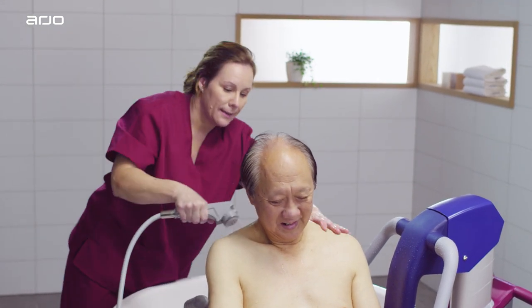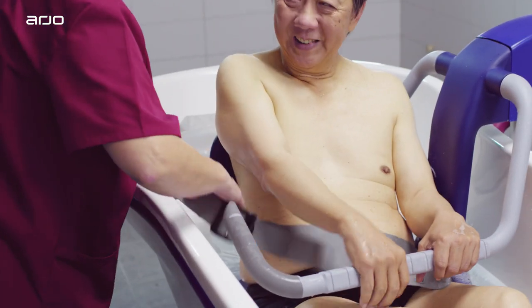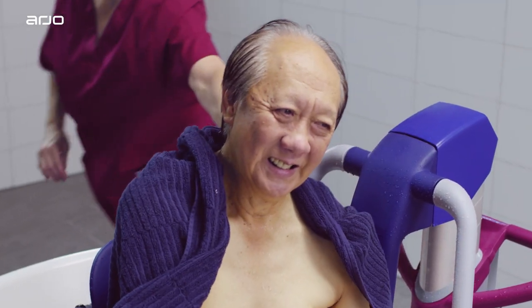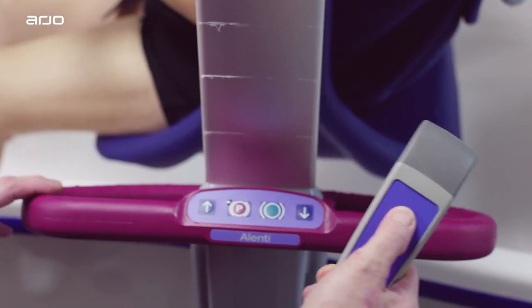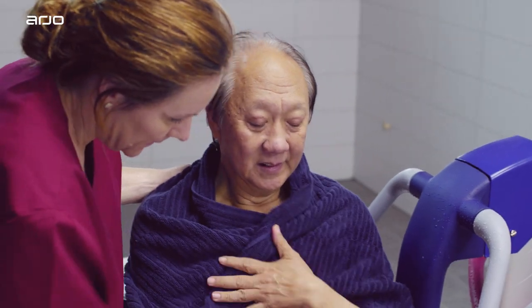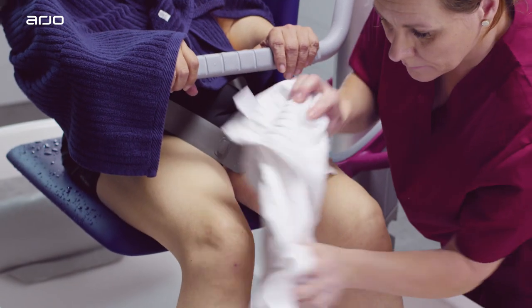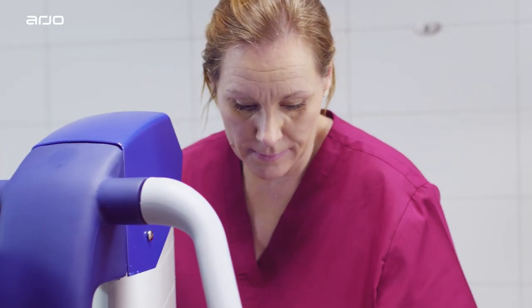After rinsing the resident with the shower, stop the flow of water by pressing the shower button on the control panel. Remember to cover the resident with towels to keep them warm. You should now separate the Alenti seat from the bottom of the bath. The resident should continue holding onto the handle while you complete this task. To do this, either lower the tub to its lowest height or raise the Alenti. Dry the resident's upper body and the underside of the seat to prevent water from dripping on the floor. Take care to use separate towels.